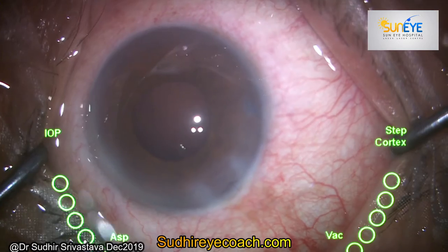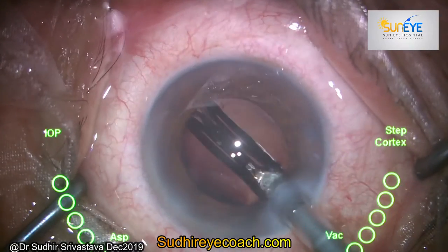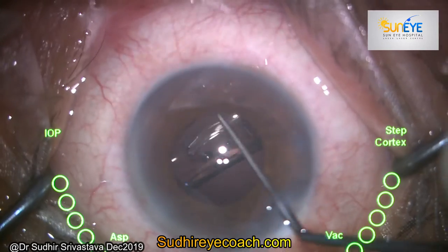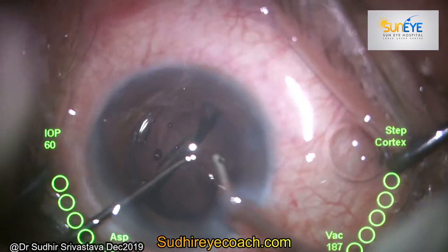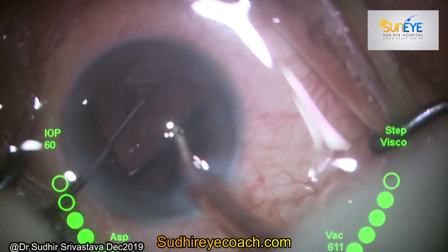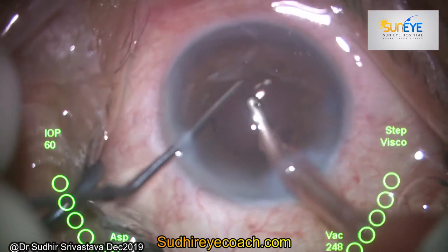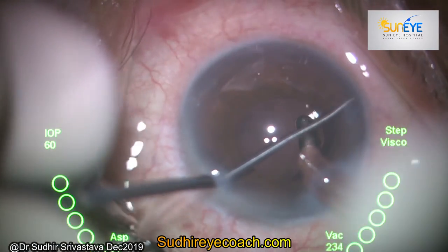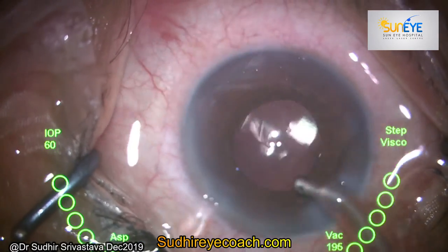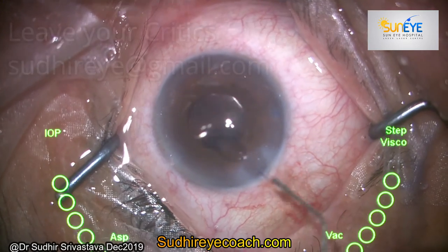Wash the posterior capsule with the hydrojet technique to polish the remaining cells and fibers, and now the eye is ready for implantation. I implanted a single-piece hydrophobic IOL in the bag. You can do cortical cleanup, go underneath the lens, remove all viscoelastic, and place the IOL in the bag. Wash the viscoelastic thoroughly from the anterior chamber at all angles and over the lens, then hydrate the wound and your surgery is complete. Please leave comments if you want any further improvements.